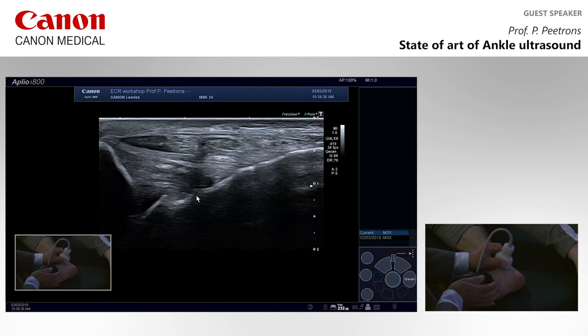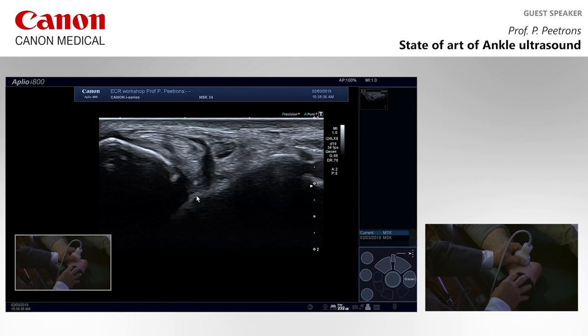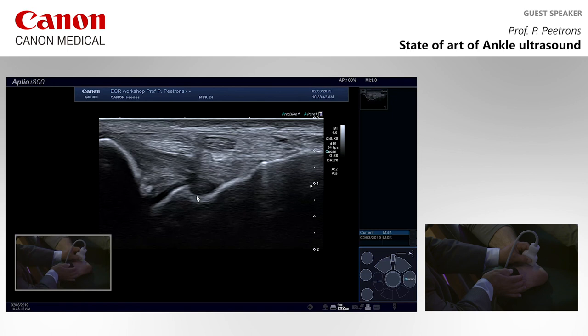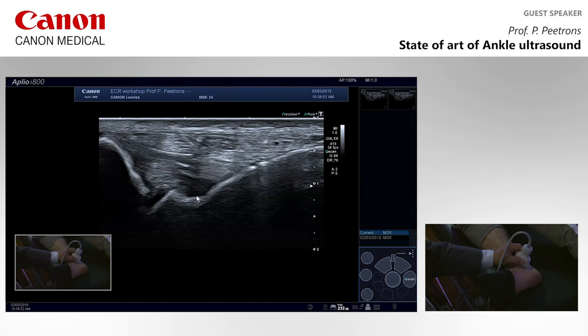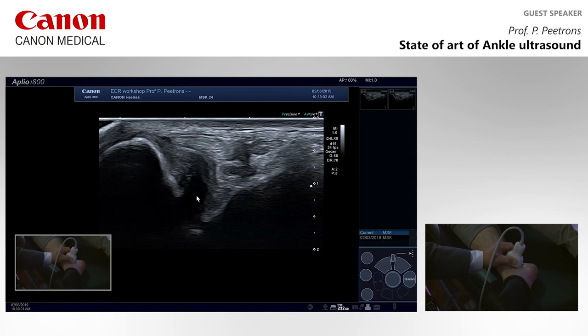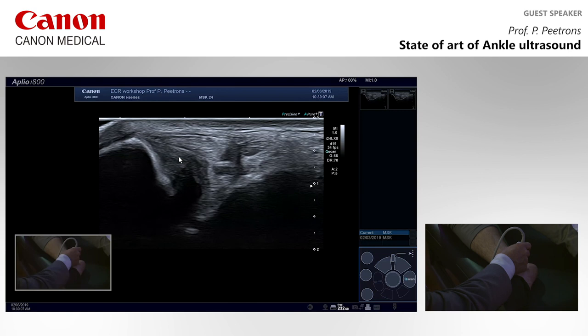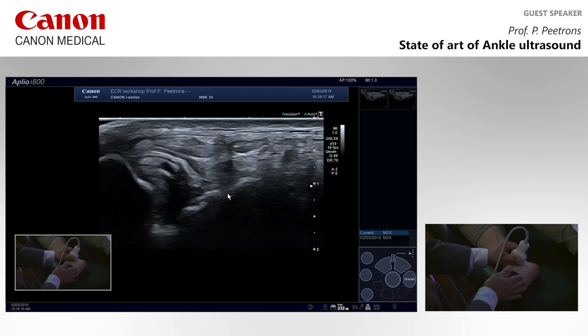Okay? So very important, stretching position and non-stretching position. The tibia and the talus are close to each other. The tibia and the talus are far from each other. And when they are far from each other, you can see this posterior part of the deltoid ligament very clearly. So this is very important. You have to think before doing your ultrasound. If you do like this, you'll say, oh, this patient has a stump here on the deltoid ligament. The deltoid ligament is not going to the talus. In fact, the deltoid ligament is coming here, going there, and going here, okay? And when you open the gate, open the gap, you see exactly what I told you. The deltoid ligament is normal.